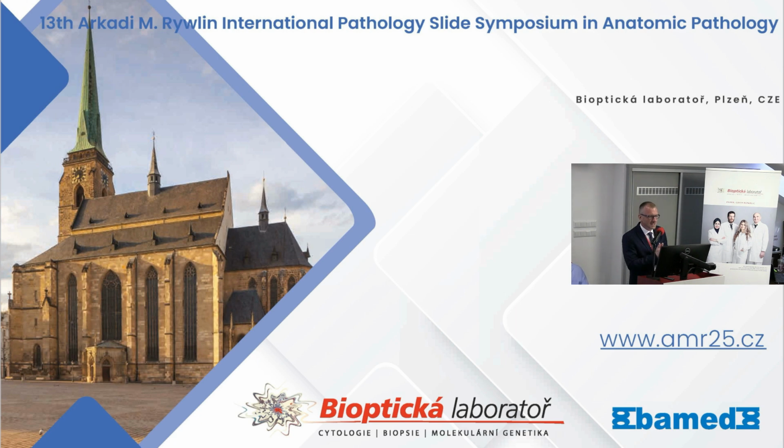But how many slides of small cell carcinoma in prostate can you get? Few. Maybe hundreds, if you have some friends around. But mostly you will call some firms to get you slides, you get some, but can you get, let's say, 10 to 100,000 slides?